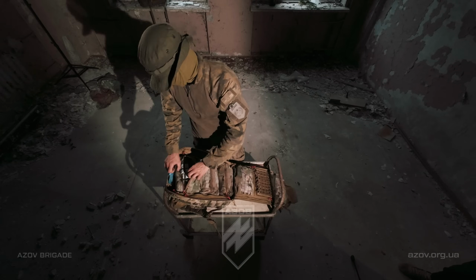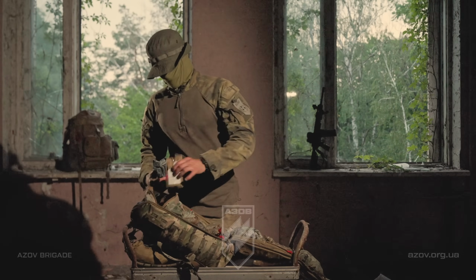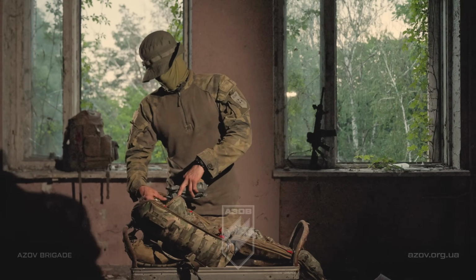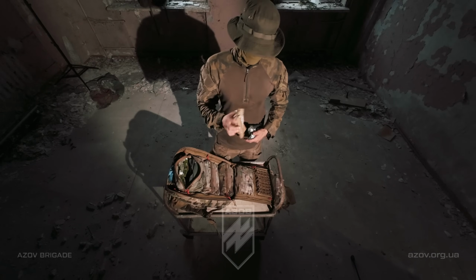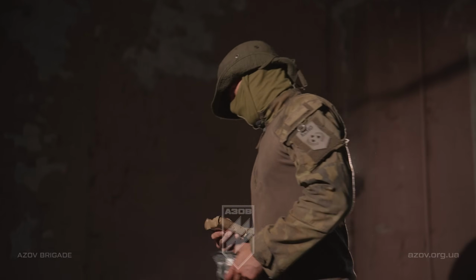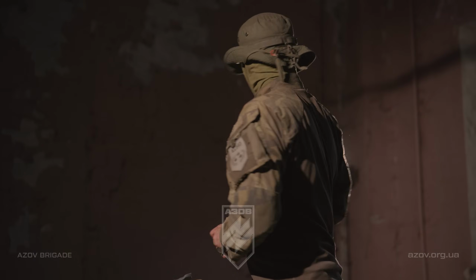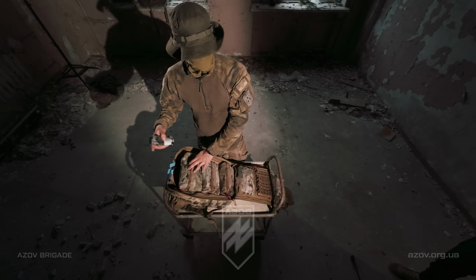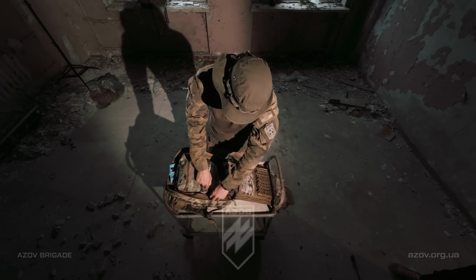So in the top here is massive bleeding. You've got Israeli bandages, some compressed Israeli bandages, sorry. Hemostatic gauze is the normal compressed gauze here. I'm a big fan of these ones, so they don't take up too much room. So you can get quite a lot of them in your kit. I need to get some more of these. So I'll probably pick up another 4 or something and try and switch out what I've got in there. There's also another tourniquet loose at the top for quick access. So you can reach in and use that.